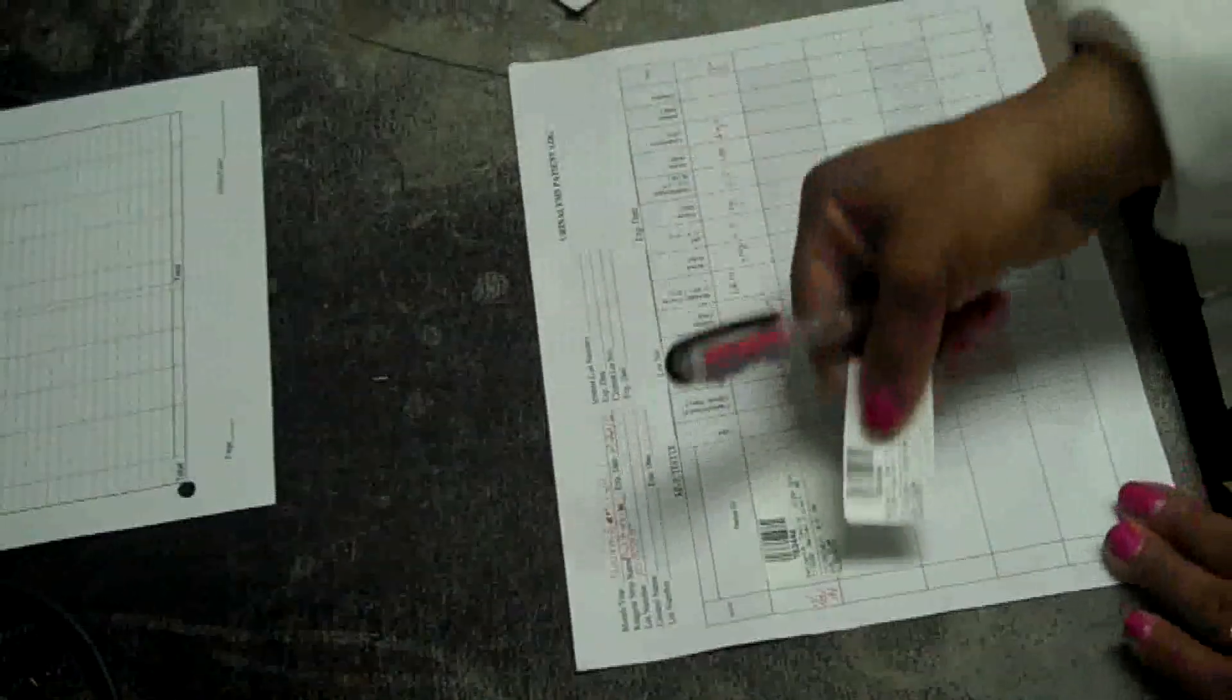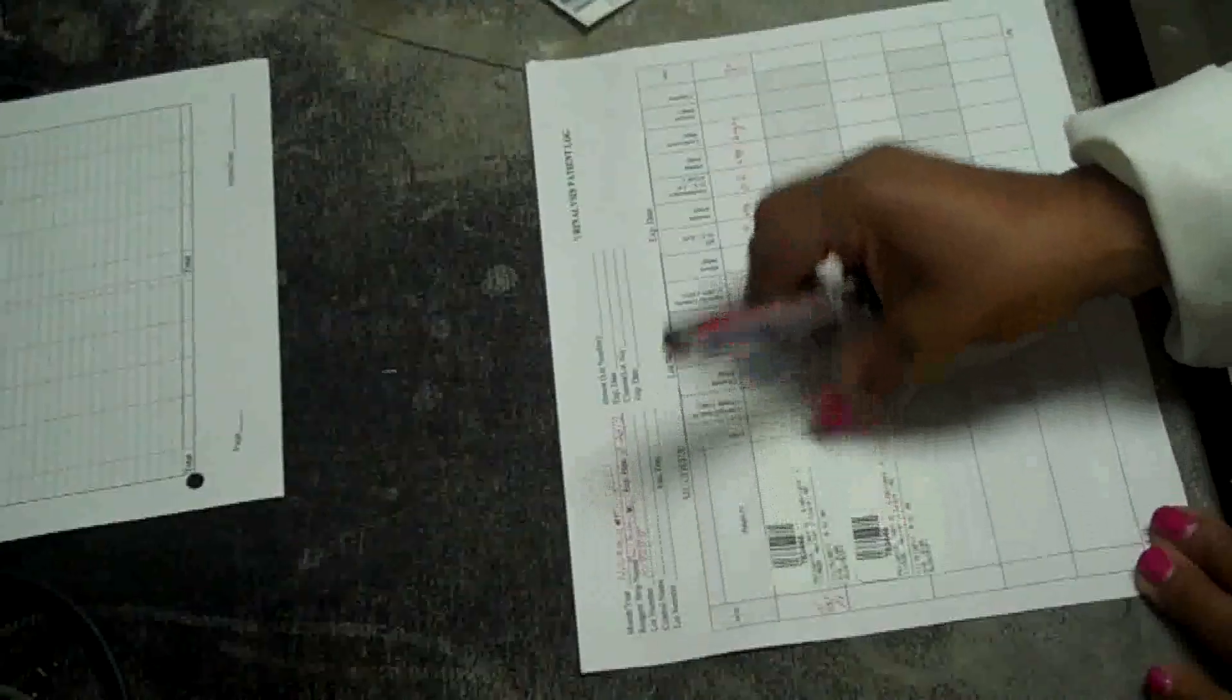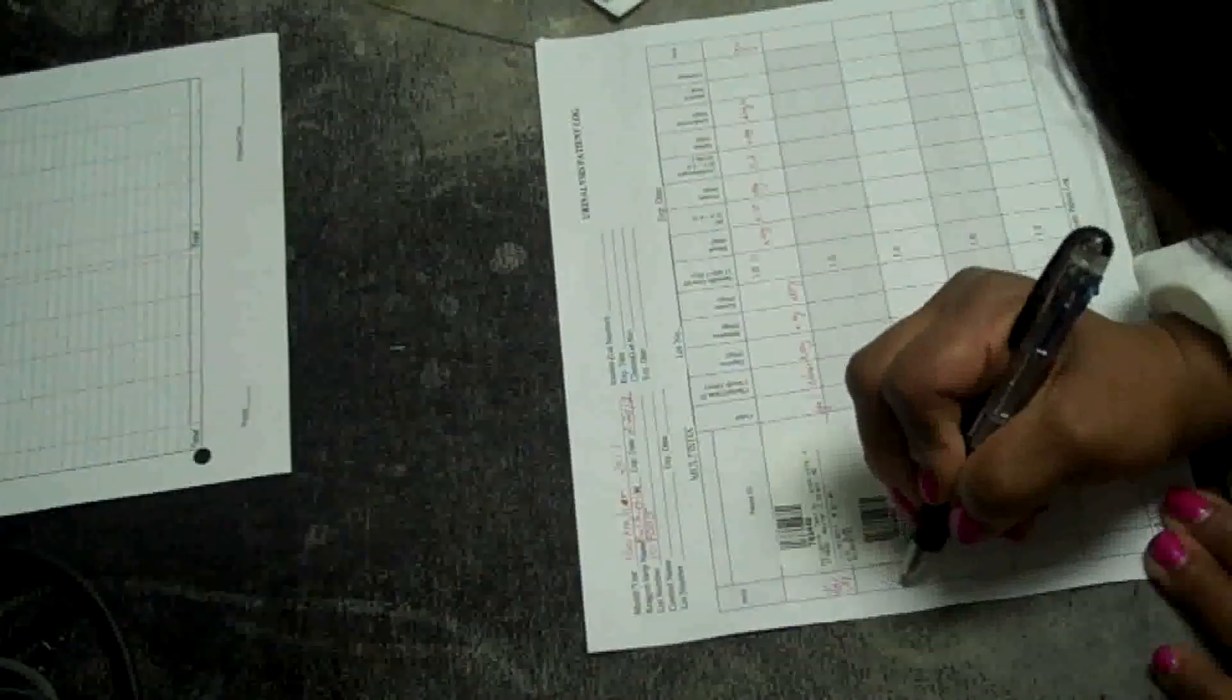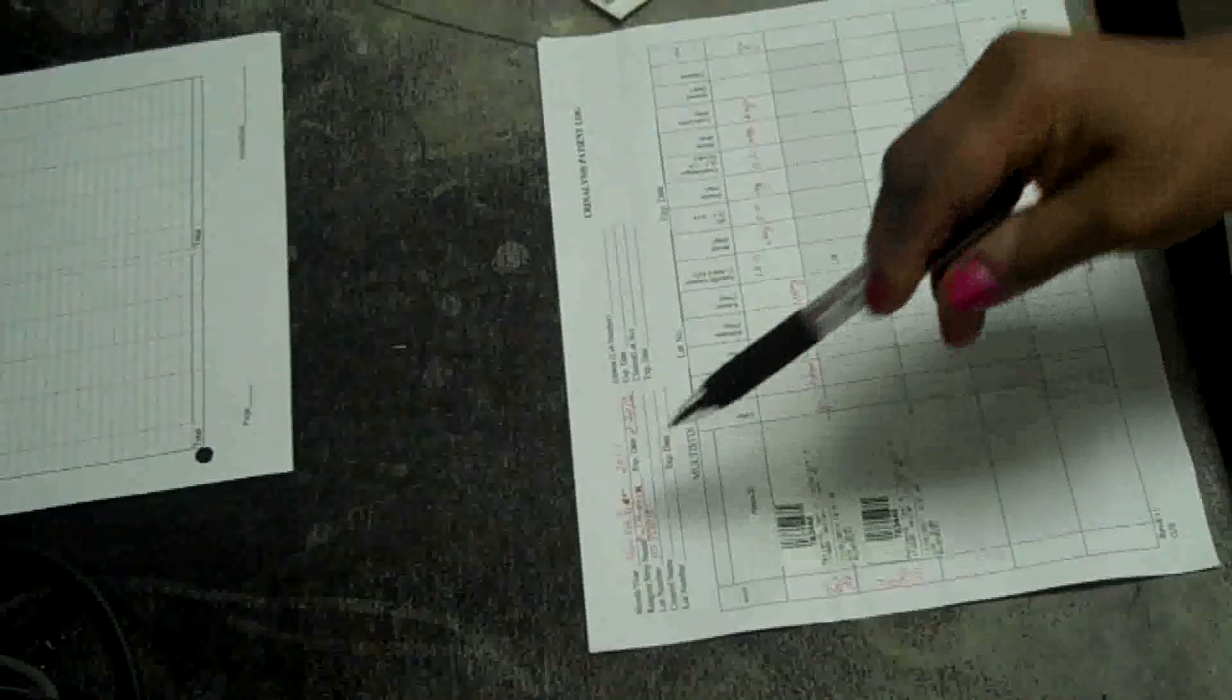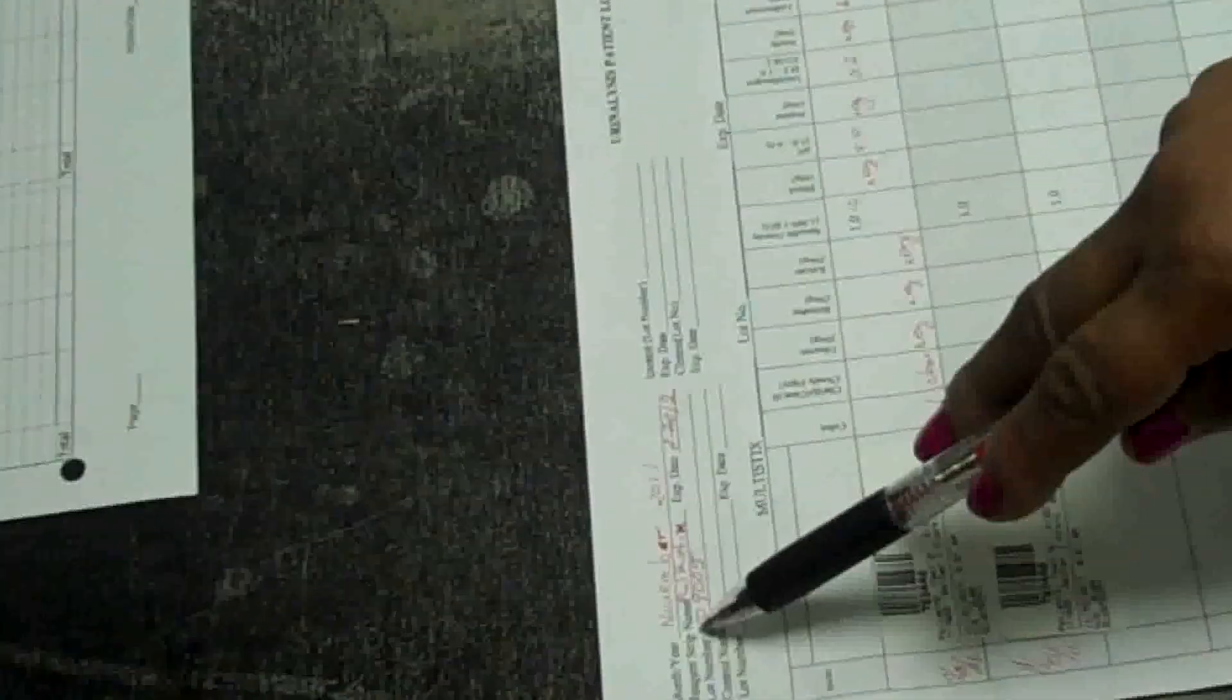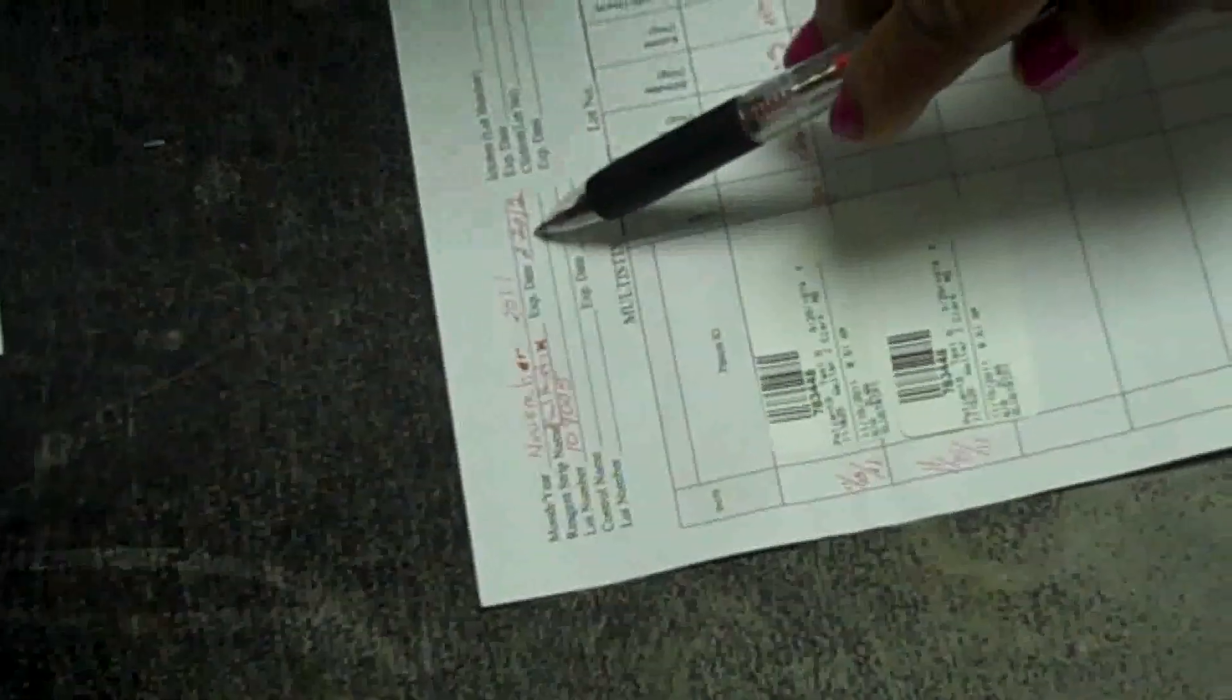Complete your urinalysis log and include your test date. Complete the urinalysis log with the month, the year, your reagent strip name which is MaltiStix, your expiration date and the lot number.